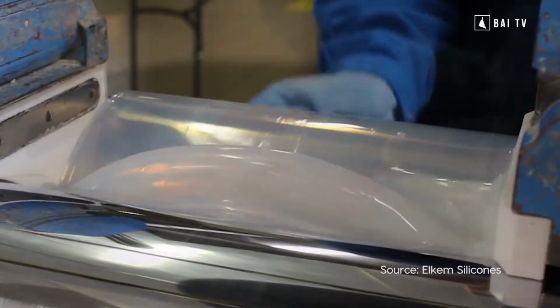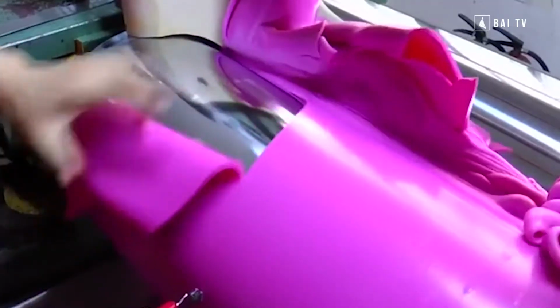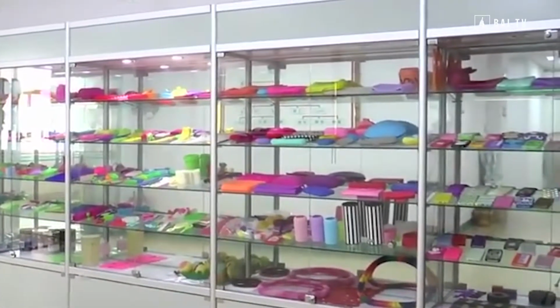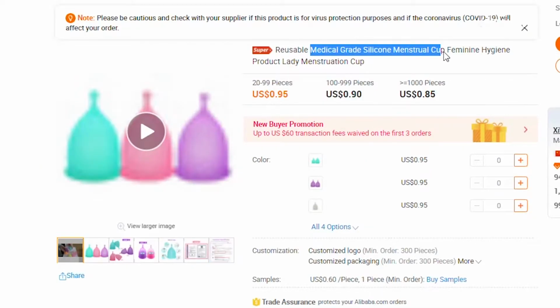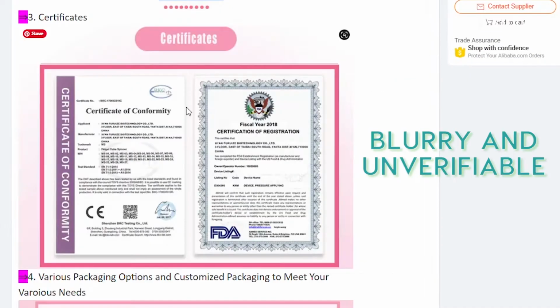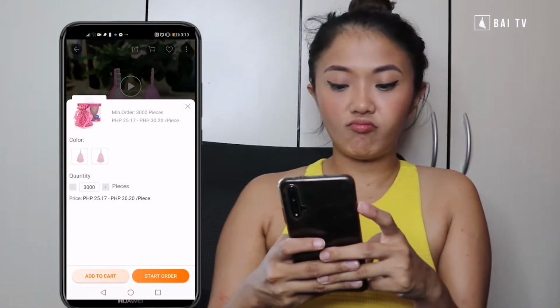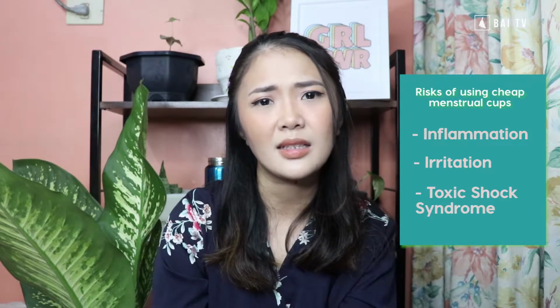Everything. Menstrual cups are made out of silicone, and not just any type of silicone, medical grade silicone. But because silicone is such a common resource and people lie on the internet every single day, silicone manufacturers mass produce unsafe to use menstrual cups in large quantities and then sell them online for really cheap. They'll say their products are made out of 100% medical grade silicone, that they're FDA approved, and yet will never be able to cough up proof for this, in hopes that a business-minded individual will buy them in stock without doing the research, rebrand them, and then sell them to me and you, eventually putting us buyers at risk of serious repercussions such as inflammation, irritation, and even worse, TSS, which could even be fatal.